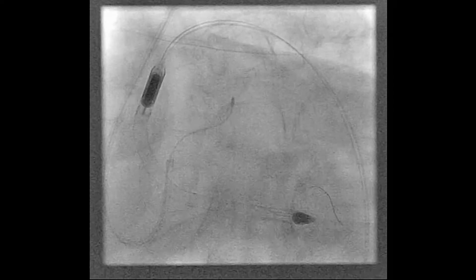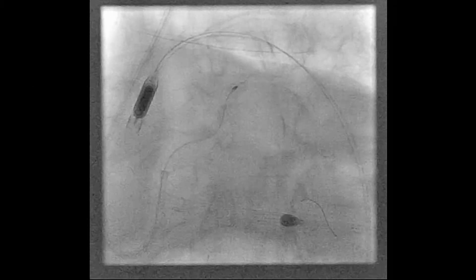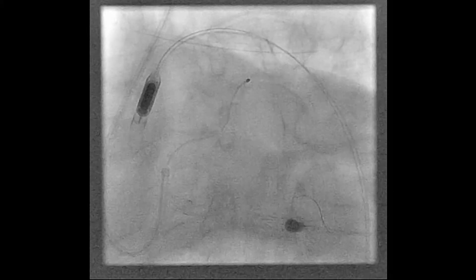And just to share this, a lot of operators have abandoned using that burr because it gets entrapped. So when you think you need rota, you might as well just consider going with the 1.5 right away, because the 125 is very risky to get entrapped because of its shape. Yeah, to be honest, it's not diamond shape, so it's different.